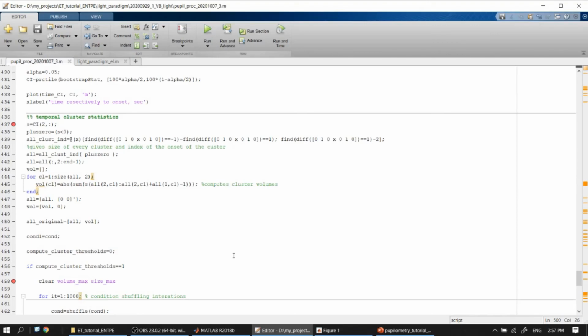I think to add a separate video on this point, because I believe that this simple and exciting tool has to be discussed better for the beginners as well as for some advanced neuropsychologists, neurophysiologists, because it is pretty simple, pretty straightforward, and useful in studies of such kind of time series, psychophysiological measures, event-related responses, and so on.